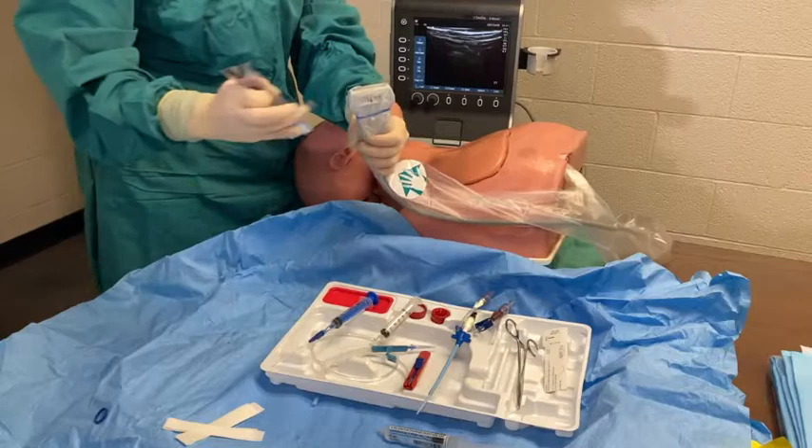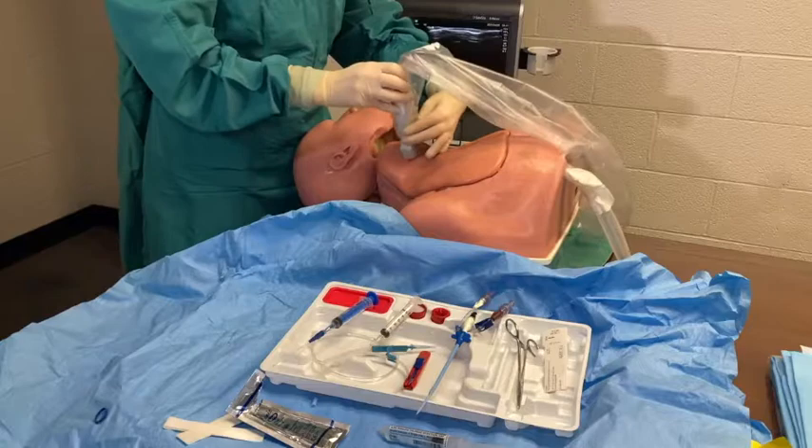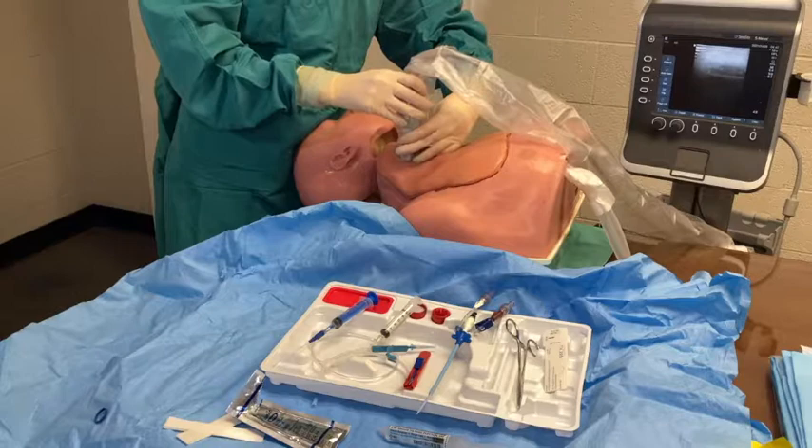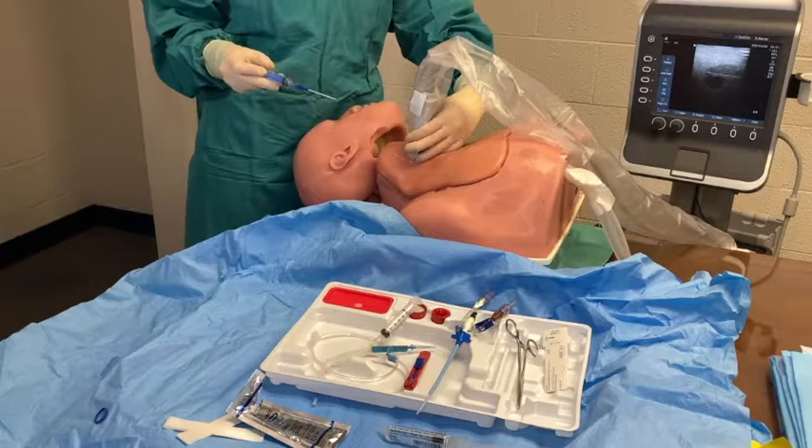Pull the sterile probe onto your field to begin scanning the right internal jugular. Place extra ultrasound jelly on the probe head before scanning. The internal jugular is lateral to the right carotid artery. You should put pressure on the probe and see the internal jugular collapse, whereas the carotid artery will not collapse.